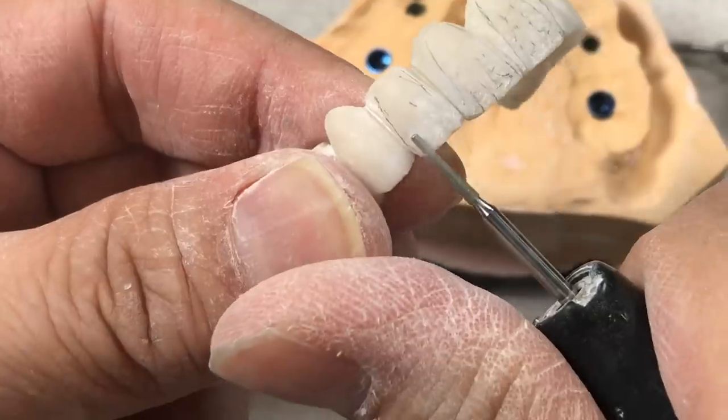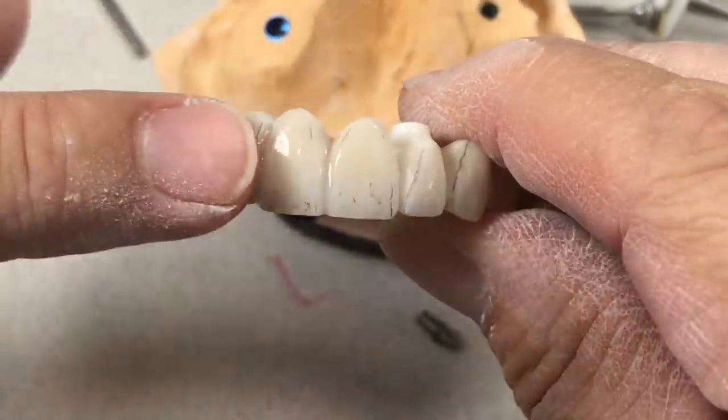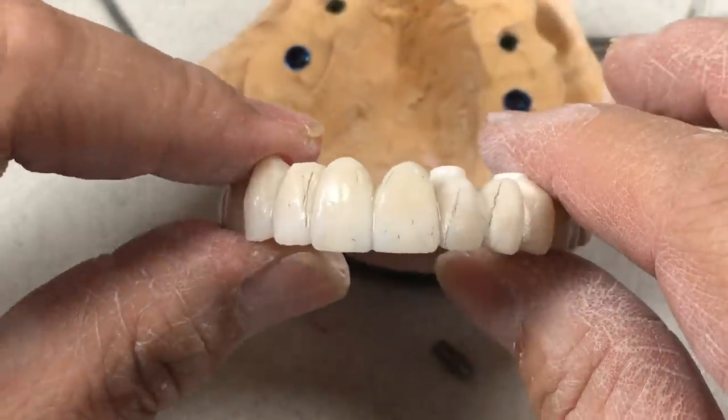Once I'm done, you can see the fingerprint like that — that's the surface texture.